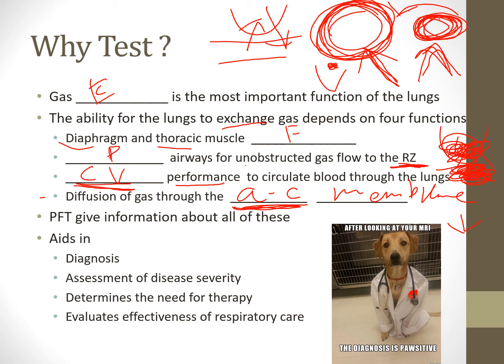So we'll do these tests on these patients that are undergoing these procedures, and the doctor will then interpret that and titrate the level of chemotherapy or the strength of the chemotherapy the patient's getting because of how it's affecting their lungs. Because obviously you don't want to destroy their lung tissue at the same time. You kind of need your lungs to survive as well, right?